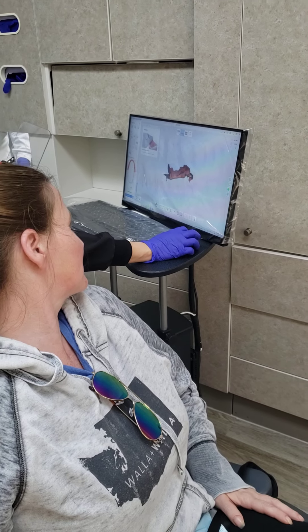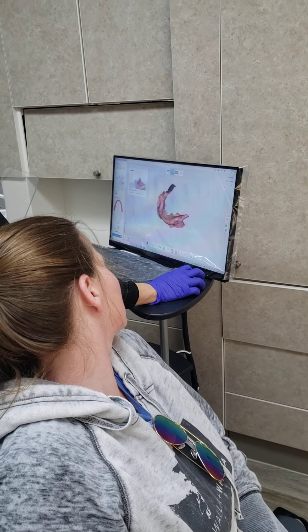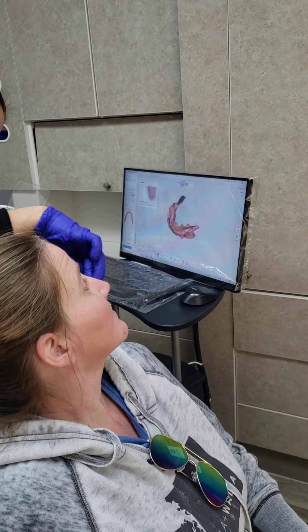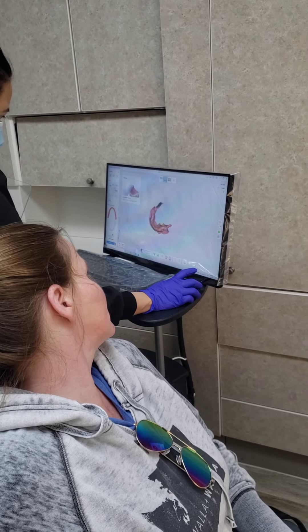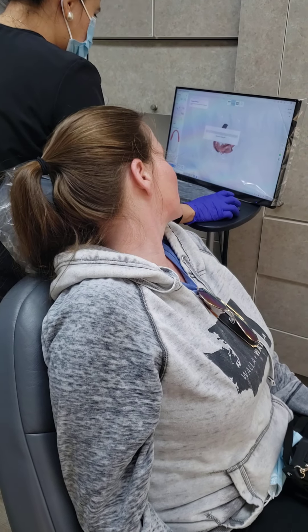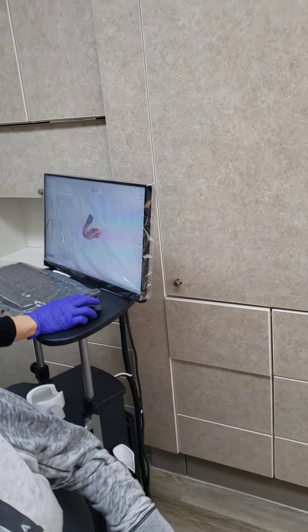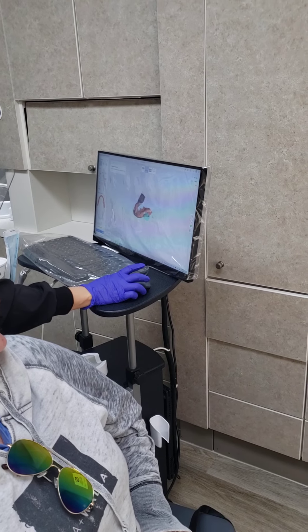The back side is like really close to the end of it right there, isn't it? What do you mean like this? Yeah, like my foot thingy there. I don't know, I guess every mouth is different though — you guys are not too far back. I just need to get right back in there and make sure that it's not far. You do whatever you gotta do, I'll just open up. And so everyone knows, Deidre, my lovely sister. Alright, I'm gonna pause this now.